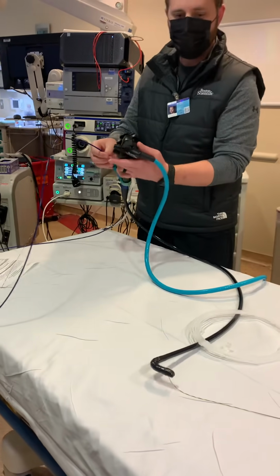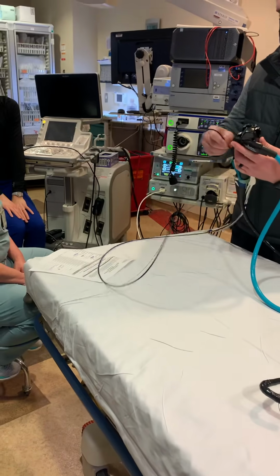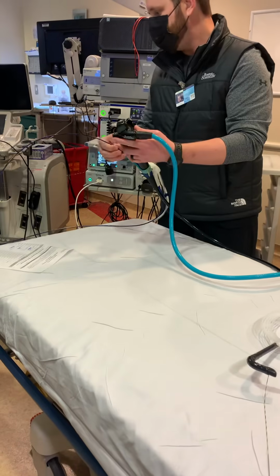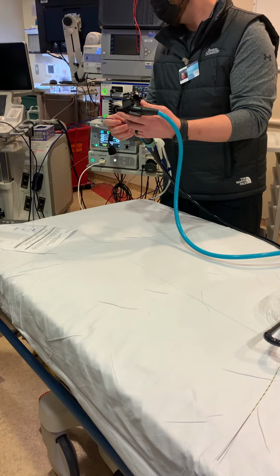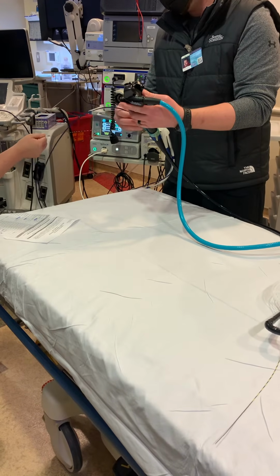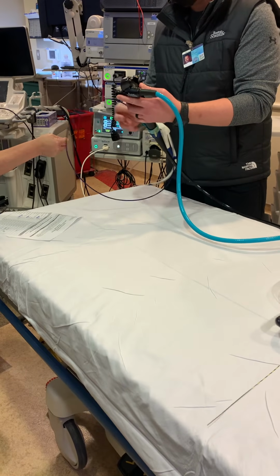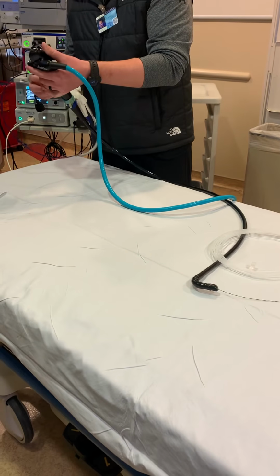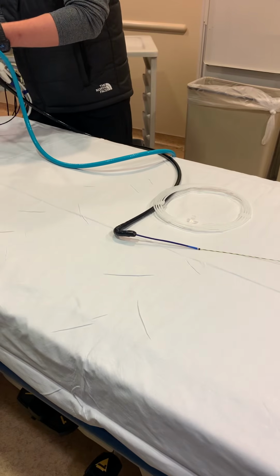At this point, your physician's typically going to lock their elevator to keep their wire from moving forward, and then they're just going to advance Spy down the scope. Cynthia, if you would, as I push in Spy, do you see all that wire coming out? Do you feel it coming out? So give me a little back tension on the wire. There you go. And I'm going to go down until I hit the elevator. Spy comes out of the scope, and you continue to provide me back tension.